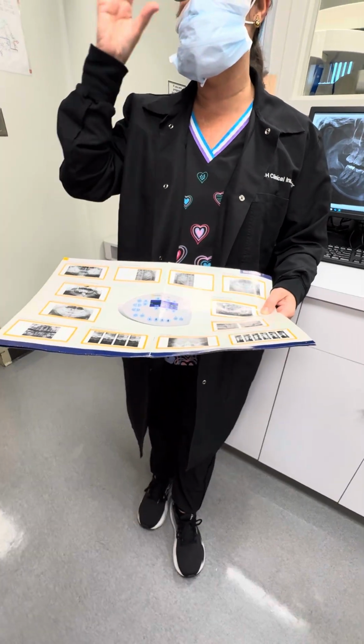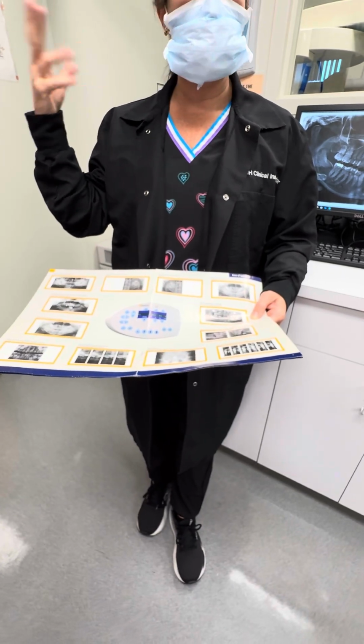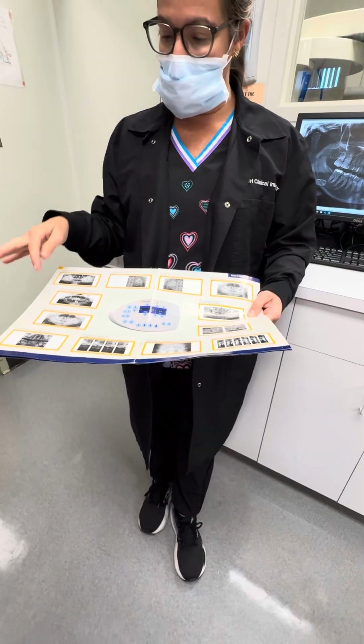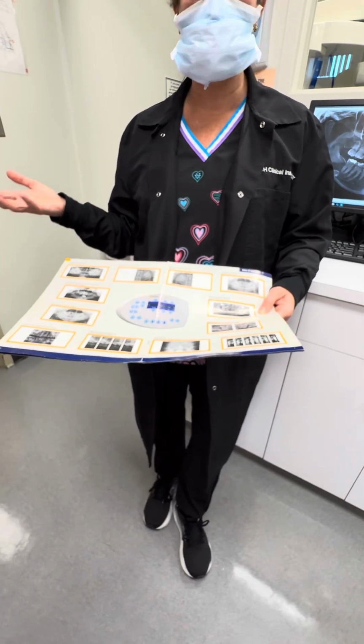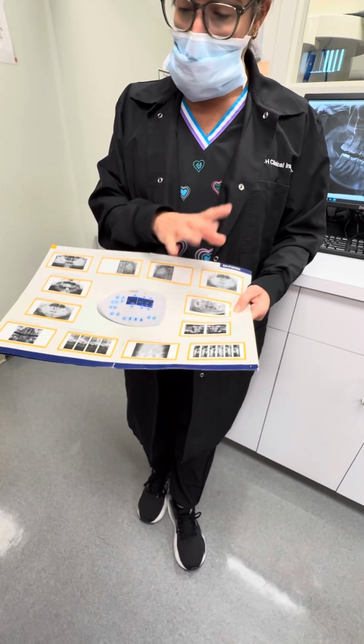So again, if you did one using the larger patient setting and that didn't work, or maybe it was too late, you could retake it again using this setting. The P12 is to obtain a thick layer of the anterior region. So maybe there was something going on there you wanted to see. You could use that as a setting. Then of course you have the bite wing. Remember me talking about that?